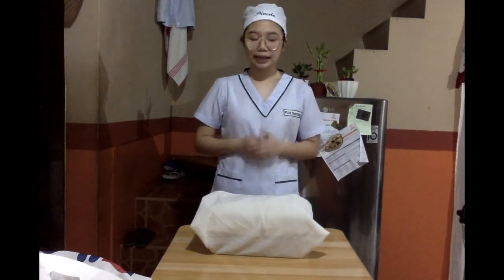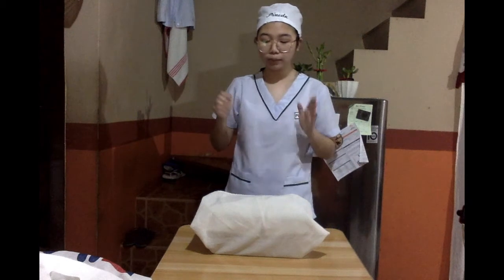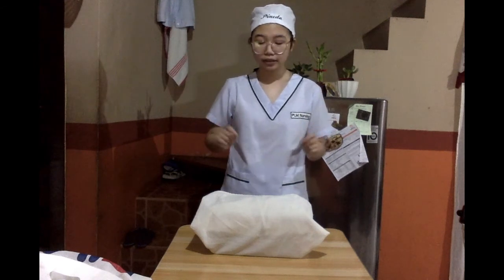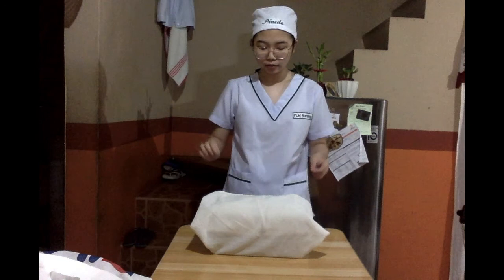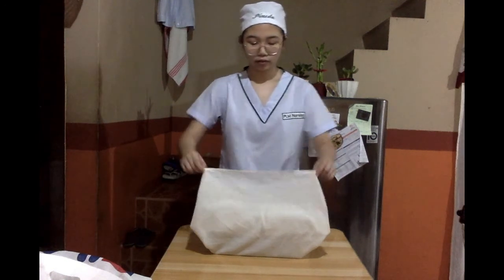After that, we will place this catheterization kit between the client's knees. This is done to ensure that the items are within easy reach. So assuming that we already placed it between the client's knees, I will now open the outer edges of this catheterization kit. Be careful not to touch more than 1 centimeter from the outside or from the outer edge. Okay.